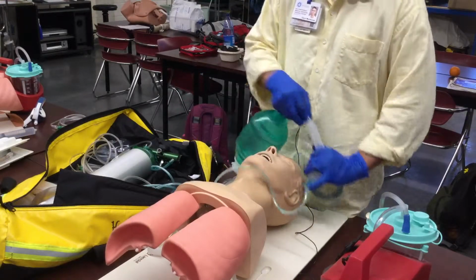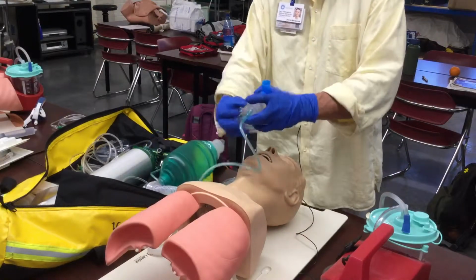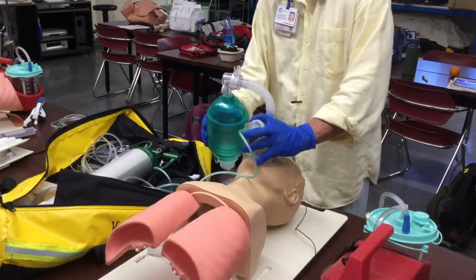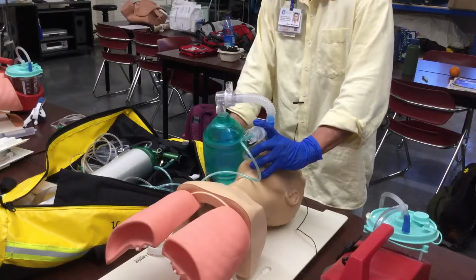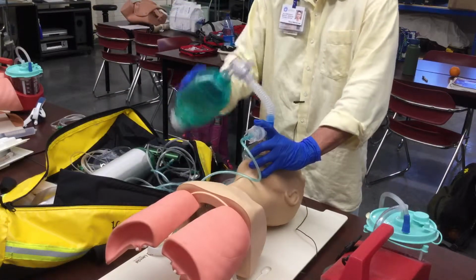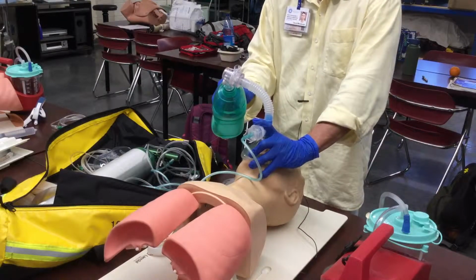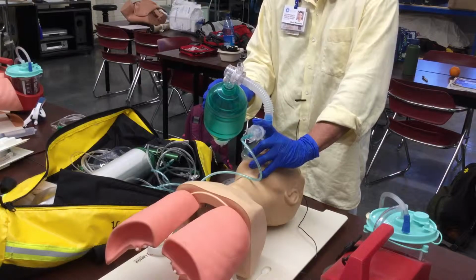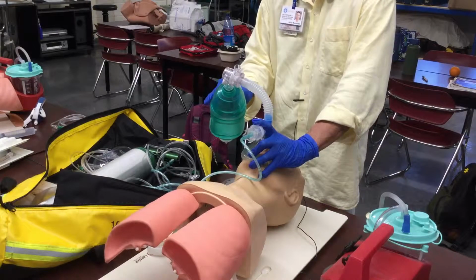We would keep the oxygen basically onto the nebulizer treatment. And I could then connect the oxygen from the bag valve mask to my oxygen tank. If I had another oxygen port, I would continue to breathe for the patient at 1 breath every 5 to 6 seconds, or 12 breaths per minute. And the paramedic states that you should put a nasal cannula on the patient.